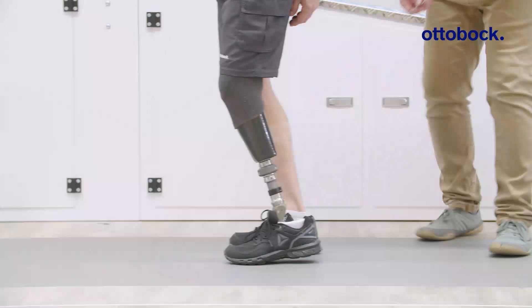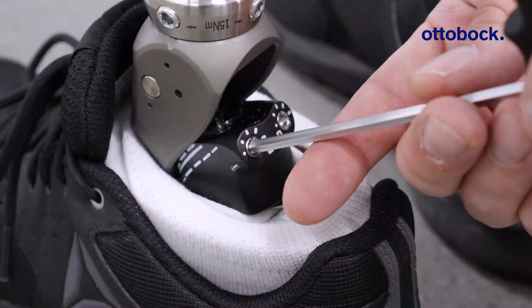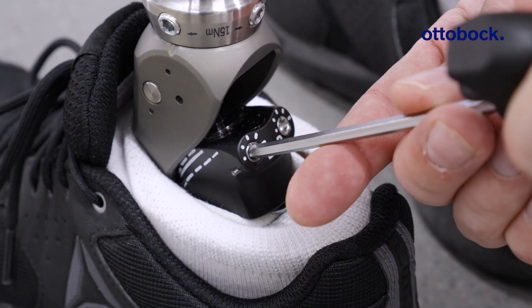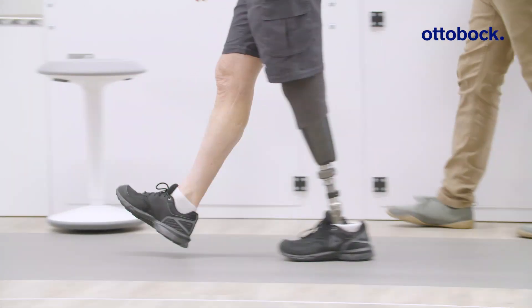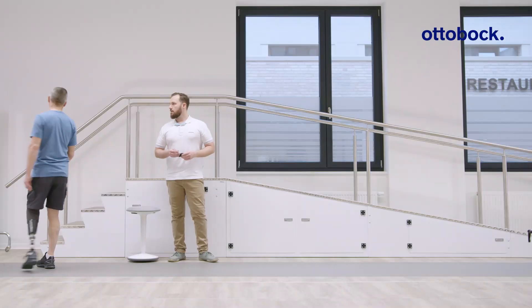Then continue by adjusting the dorsiflexion resistance. Look for a smooth transition to the dorsiflexion stop and observe if the knee joint is extended during mid-stance.